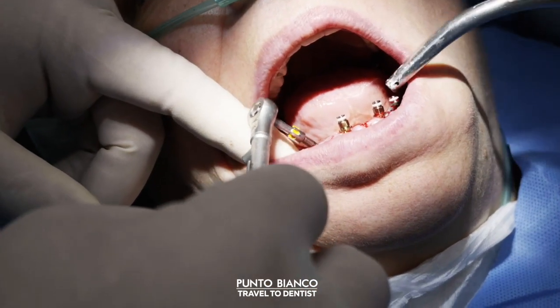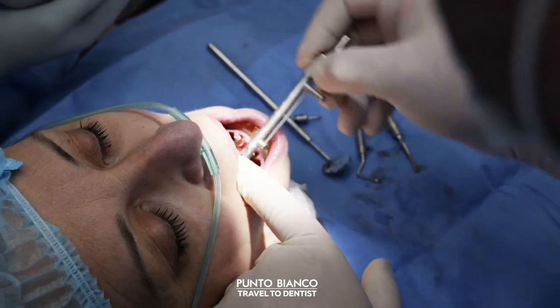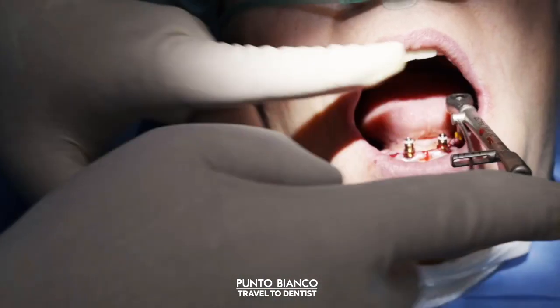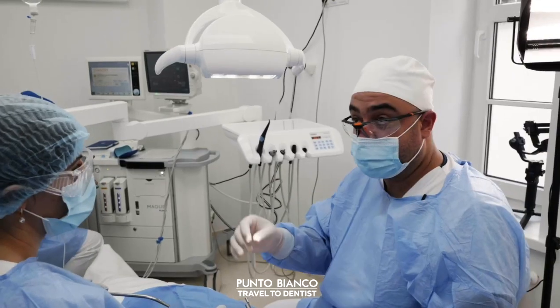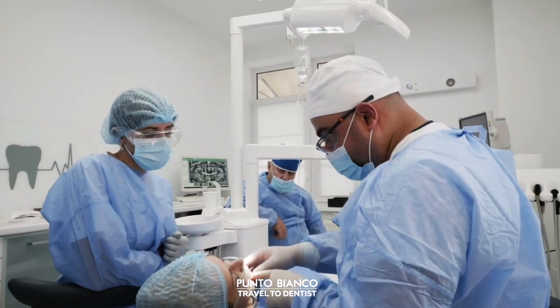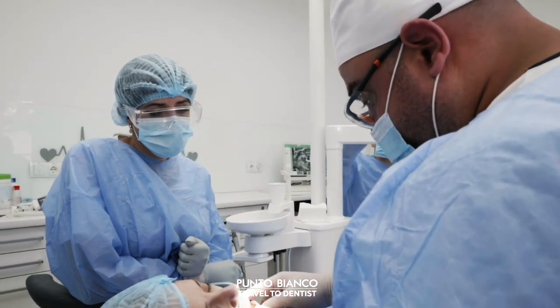The implants were inserted using a surgical guide. So they changed the implant to a bigger size. So I made a reservation, right? Yeah, I made a backup and it worked perfectly. I decided to upgrade to a larger implant and afterwards, we were finally able to achieve the level of stability that we needed.